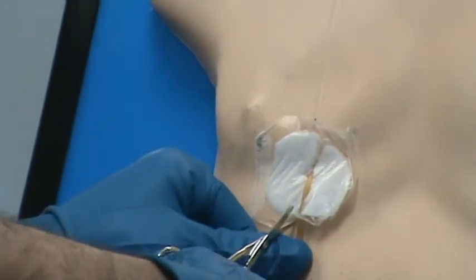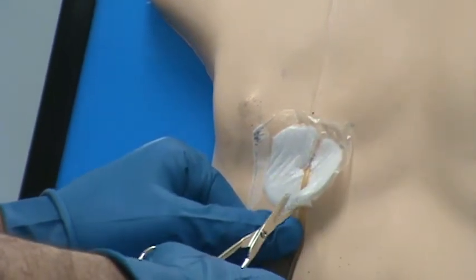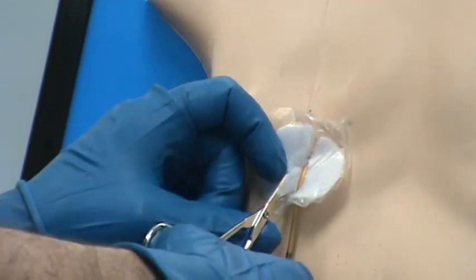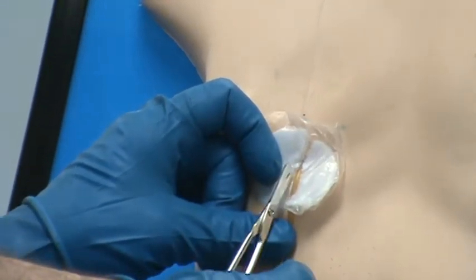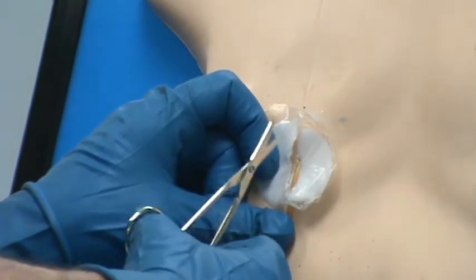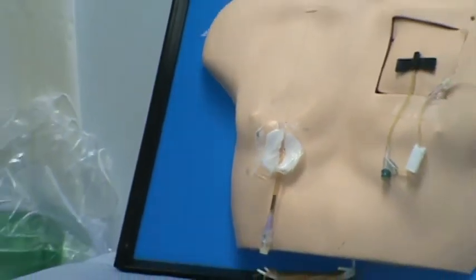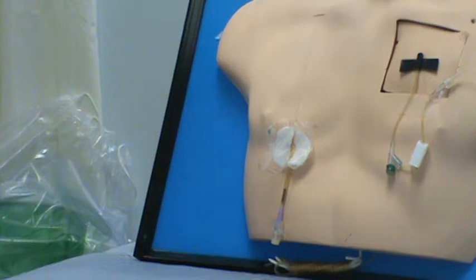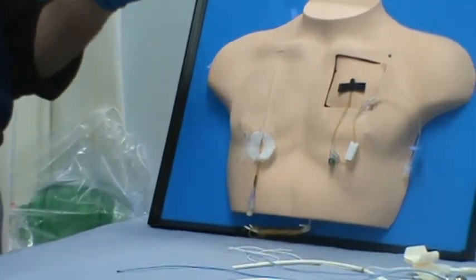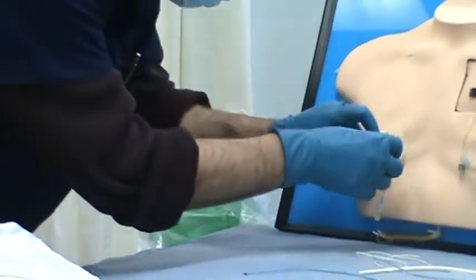So here we go. I'm going to go ahead and cut this very carefully up the line, because one of my colleagues totally screwed it up. Now I'm not saying this to the patient, no matter how mad I am, because they might have to take care of this patient again. But now I know who to be mad at. Throw that down. So always in front of the patients, you stay calm and cool. But hey, you can be mad at your colleagues, that's okay. Happens all the time.